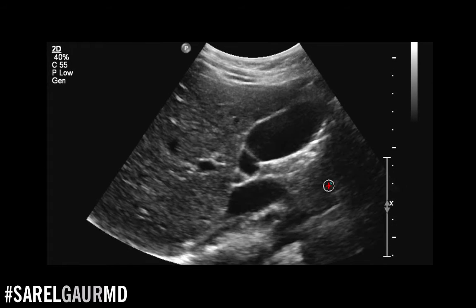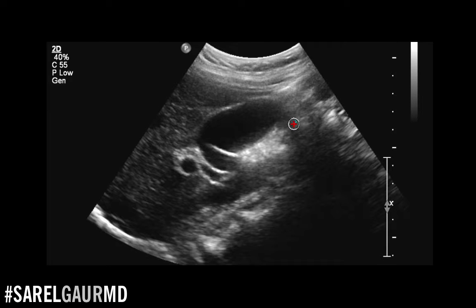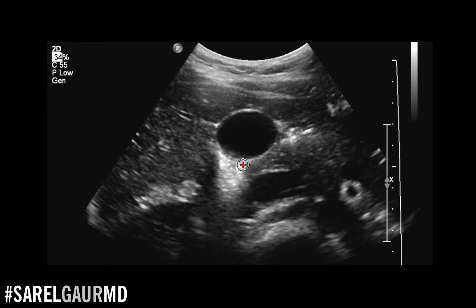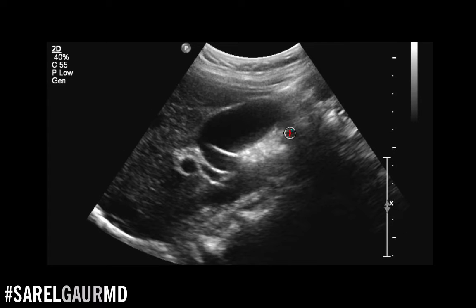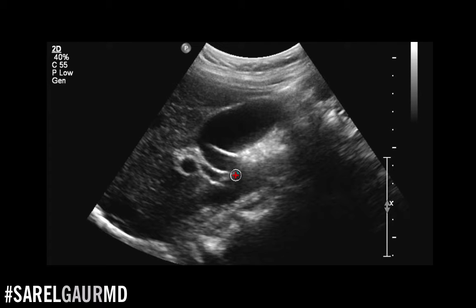How do we image a normal gallbladder on ultrasound? We get two views: a long axis view where the gallbladder appears elongated, and a short axis view where it looks relatively oval. You can see some normal folds of the gallbladder. We're looking at the fundus, the body, the neck, and we try to look at the cystic duct if we can — though we don't typically get a great look at that on ultrasound.